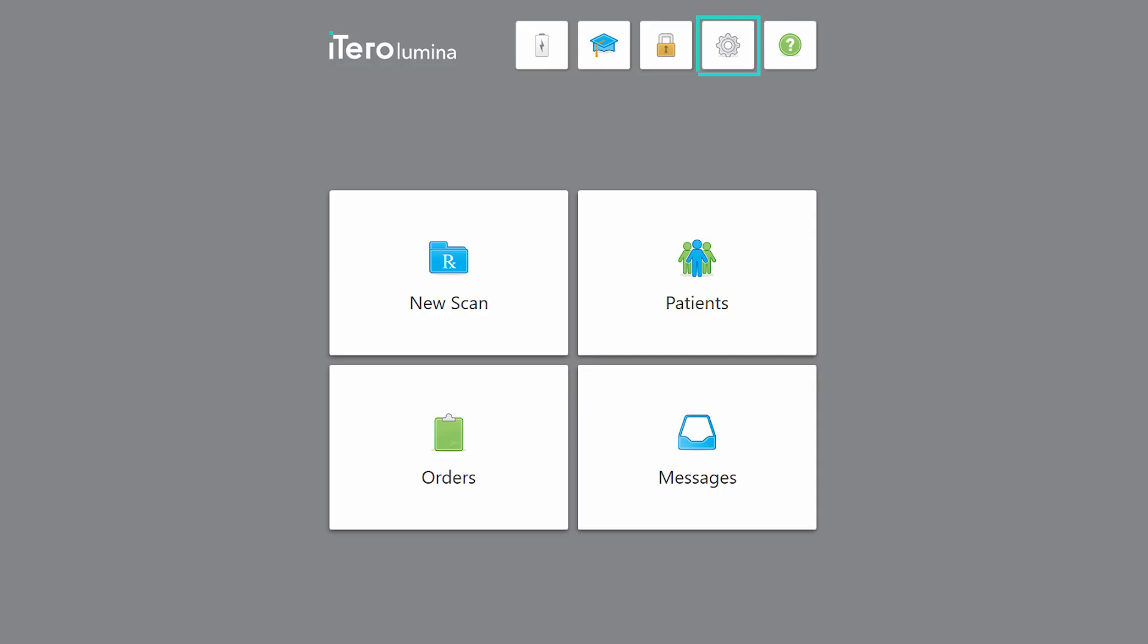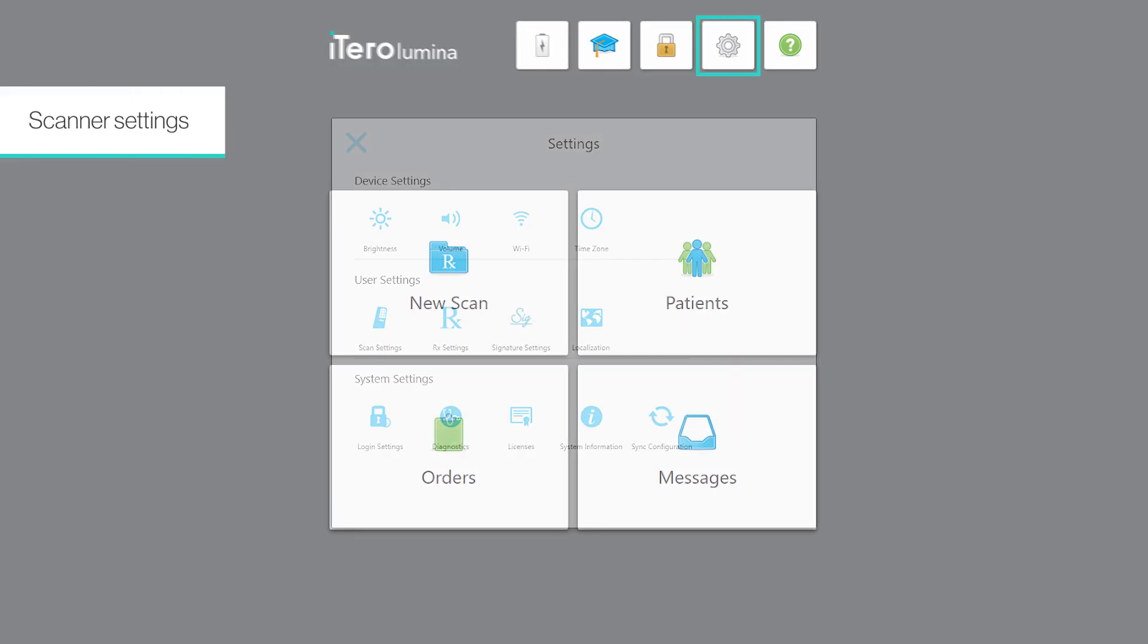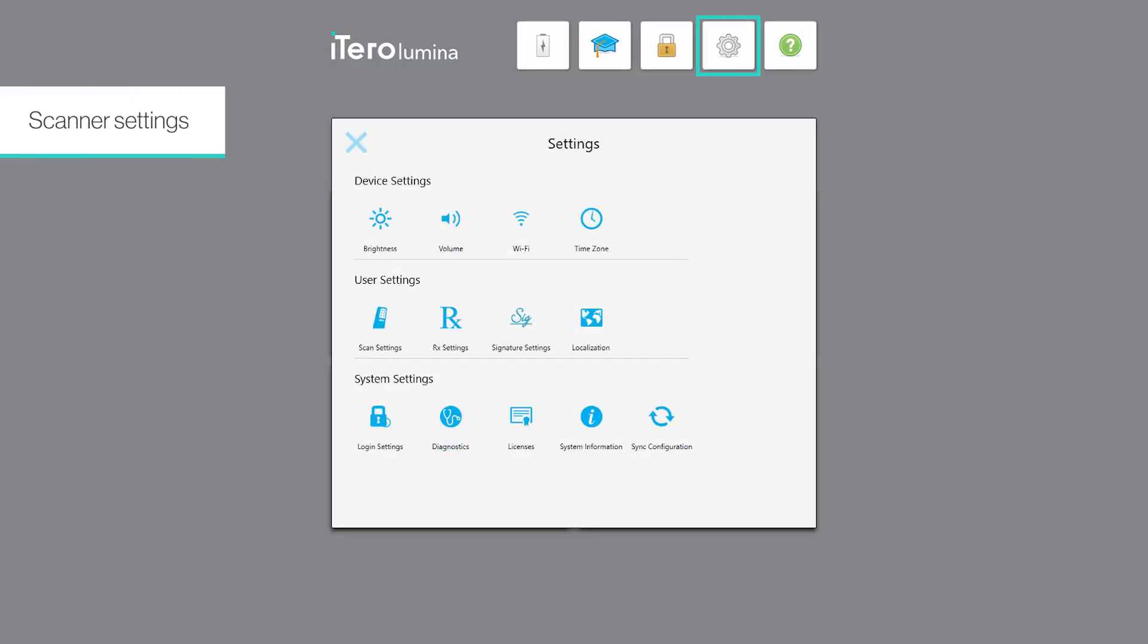Tap the settings icon to access the settings menu where you can adjust the following scanner preferences.